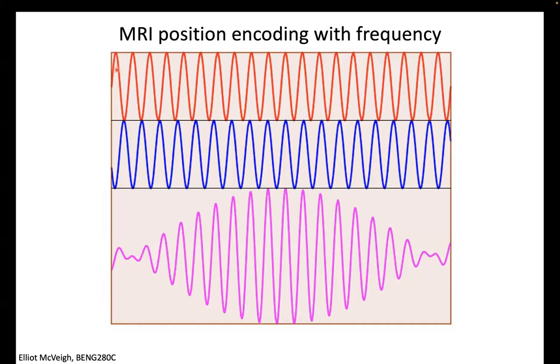So if I have a magnetization vector that's resonating at this frequency, it's going in the transverse plane. Obviously, this is idealized in that it's not decaying over time, but it's rotating around. And then there's one that's at a slightly lower frequency here. When you add those up, you get the sum of this magnetization vector and this one. And encoded in this sum are these two frequencies, right? So this is what we're going to measure in our coil if we only had two magnetization vectors. And we would have to look at this signal and decode where it came from, right?